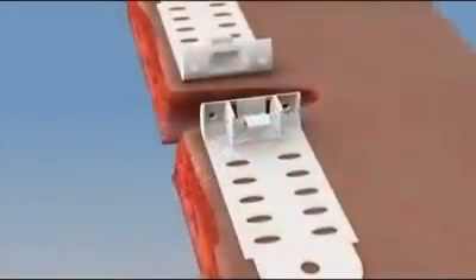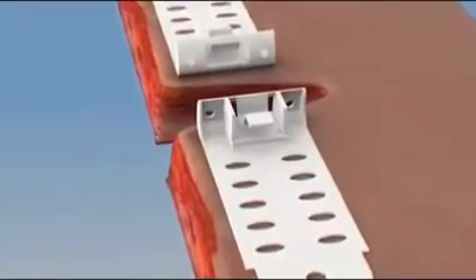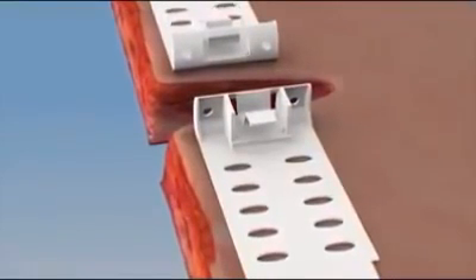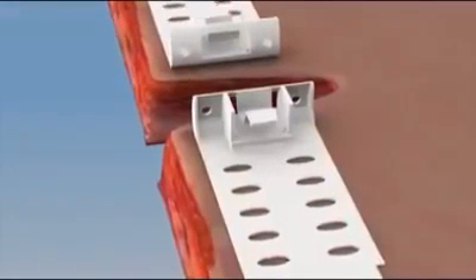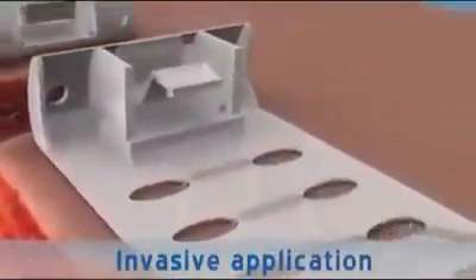The TopClosure 3S system can also be attached to the skin invasively using staples, sutures, K-wires, or a combination of the above during surgery. The plates are secured to the skin by application of staples.